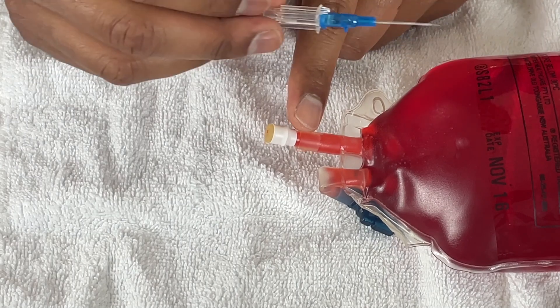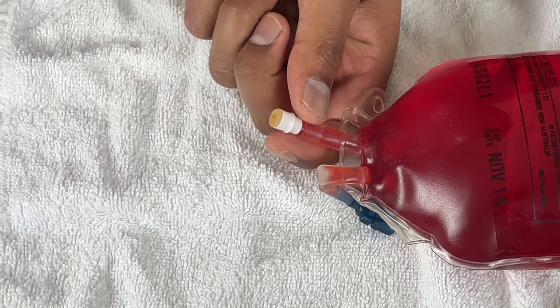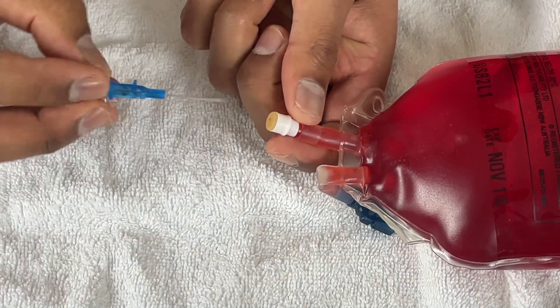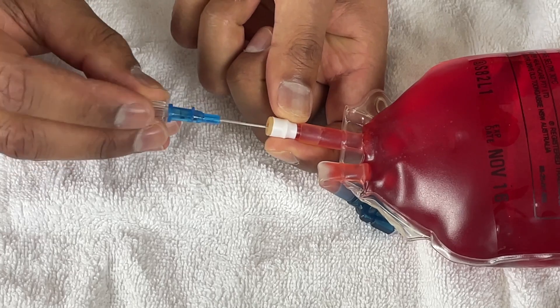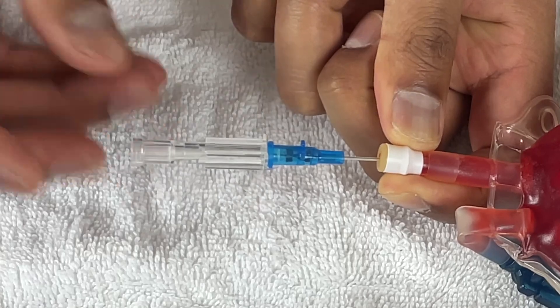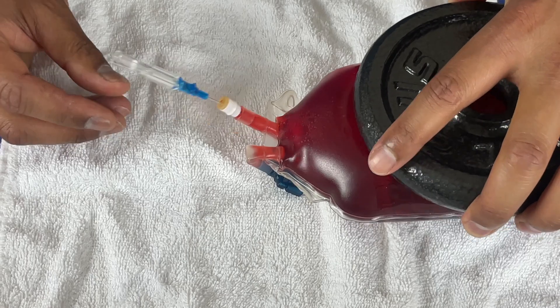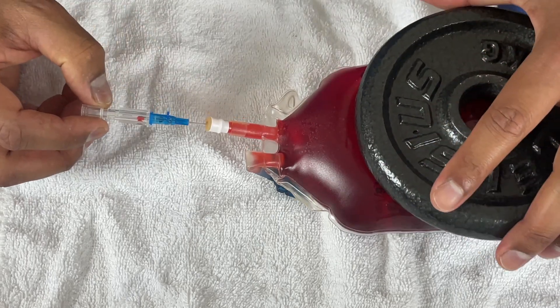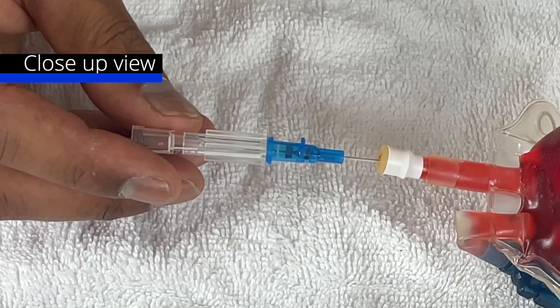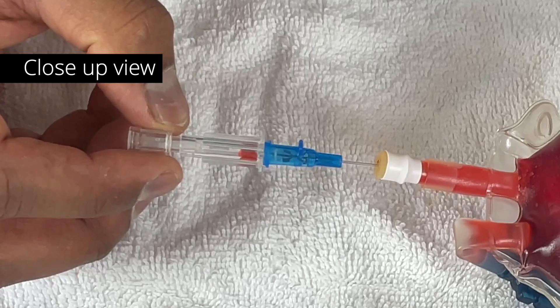The pressure in this bag is actually not very high - there's a lot of laxity in it. So if I use this 22 gauge needle and put it through this artificial vein, you'll see there's actually no flashback occurring. It's only through an increase of pressure - like squeezing the bag - that you get that flashback occurring. So you need some kind of venous pressure for flashback to even occur.